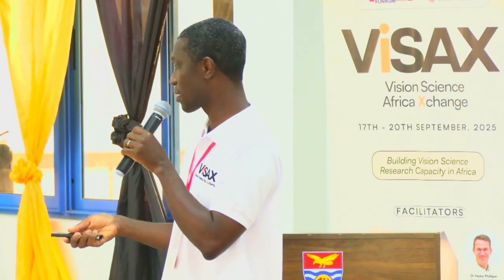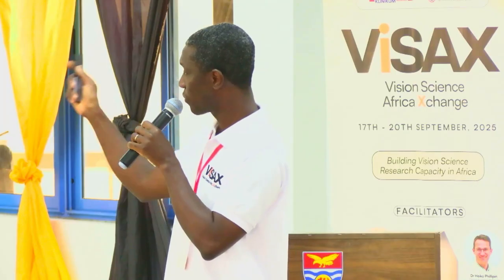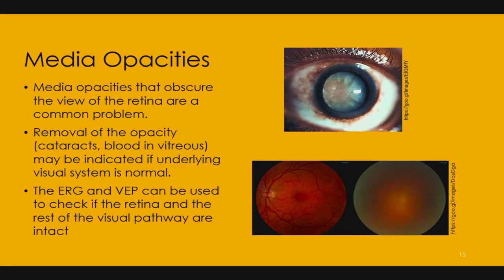Clinical applications, there'll be more by Prof. Sven and Heiko, so I won't talk too much about it. But you have someone with cataract or the media is opaque. Let me talk about the case we received. We had a case of a trauma. The case was referred to us. He had trauma. They couldn't see through the eye, and there was a question whether the eye was worth saving.